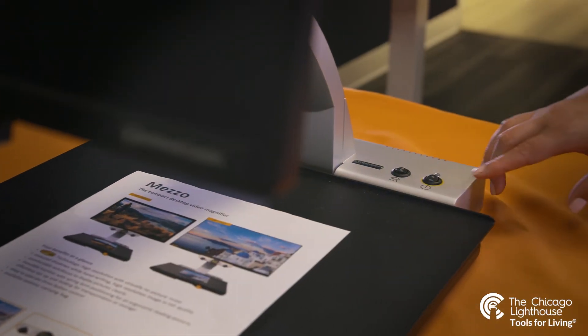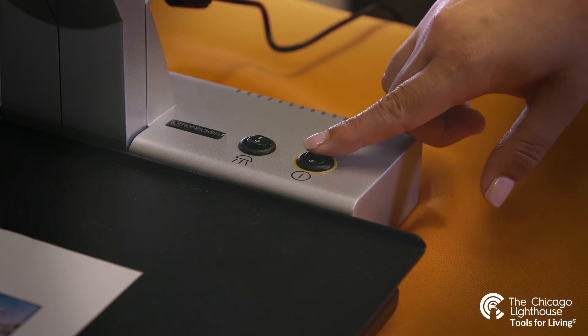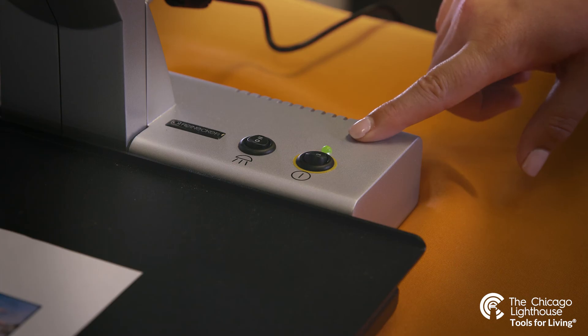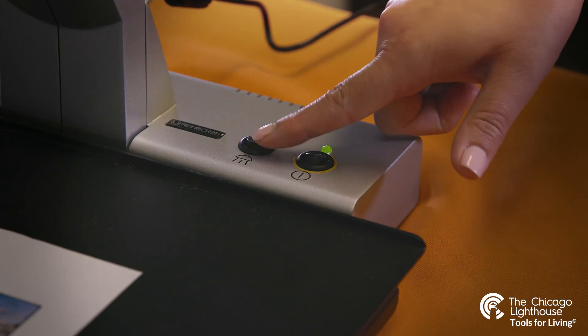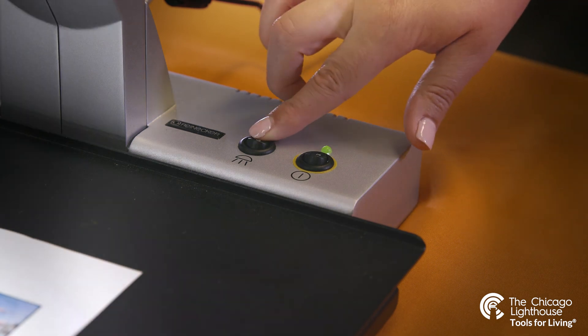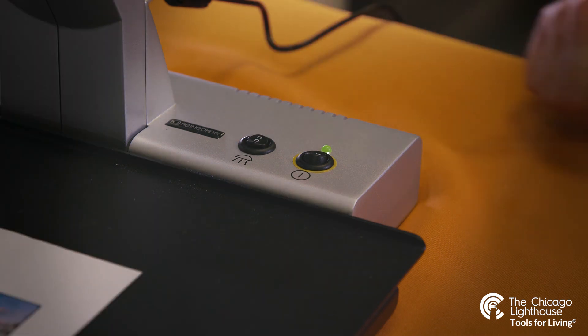To turn the device on, we will reach along the back side of the device to find a black power switch. It is the right of two available switches back there. The second switch on the left controls our light levels. Forward on the light switch will give us 50% light, flicking the switch back will take us to 100% light, and should we wish to turn the light off we can put the switch in the middle.